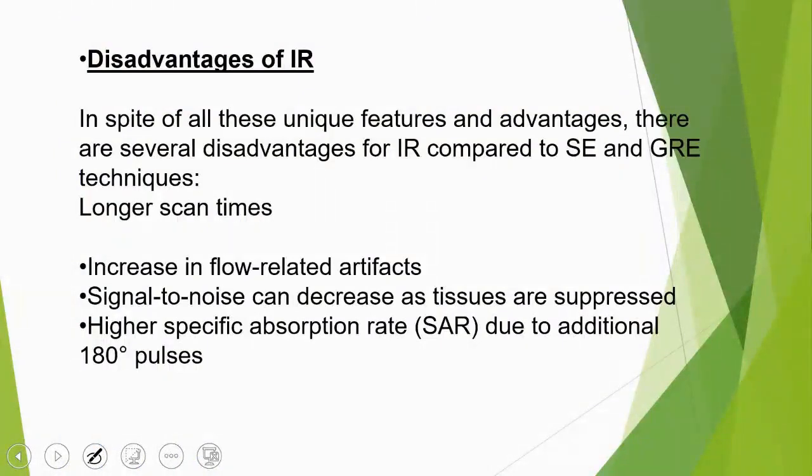Of course, the problem with inversion recovery is that artifacts appear with it, and it requires a more homogeneous magnetic field. It can be performed on open MRI, but with a higher magnetic field, it will be better. It's not the same as fat saturation, which requires a higher magnetic force because you need a significant difference between fat and water. However, FLAIR and STIR can be used with open MRI.